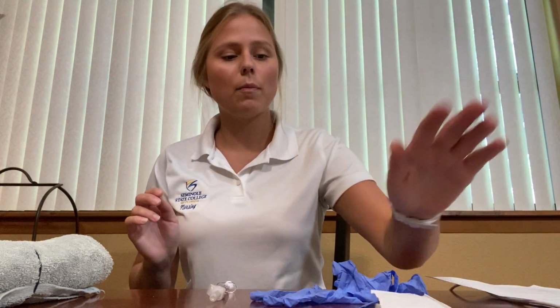So then before I go in, I'm going to assemble my necessary equipment. So I've got my medication, I've got my gloves, alcohol pad, I've got gauze. Then I'm going to knock, knock, knock, wash my hands, identify myself.